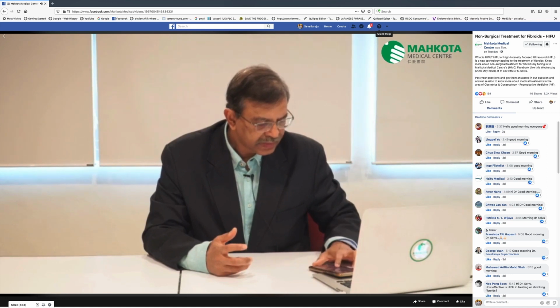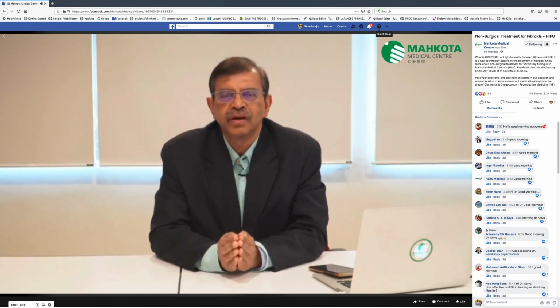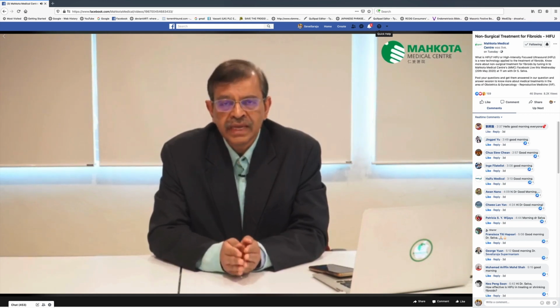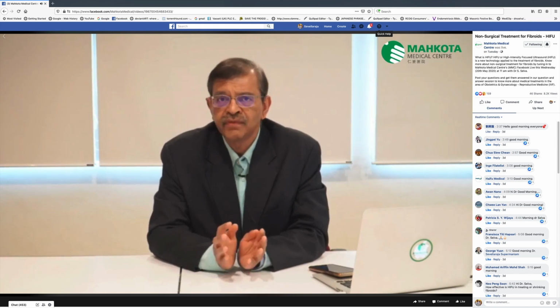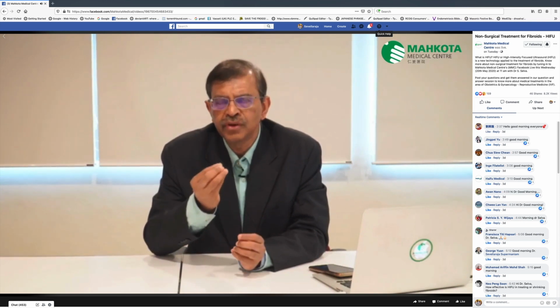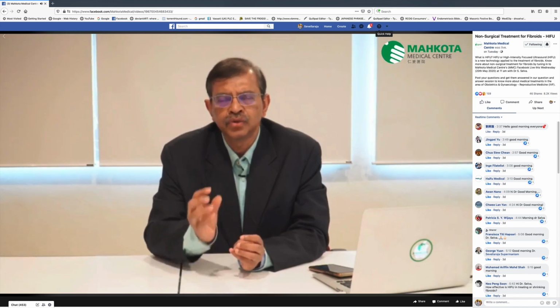Okay, the next question is, can HIFU treat other diseases? Now, I'm a gynecologist, so I'm only talking to you all about using HIFU to treat fibroids. We can use HIFU to treat adenomyosis. That is another difficult disease. Now, adenomyosis is different from fibroids. People get confused. Adenomyosis is actually endometriosis within the muscle of the uterus. So we can use this treatment to treat adenomyosis.